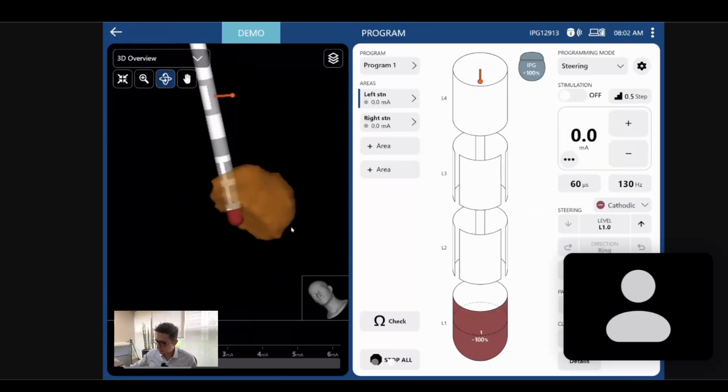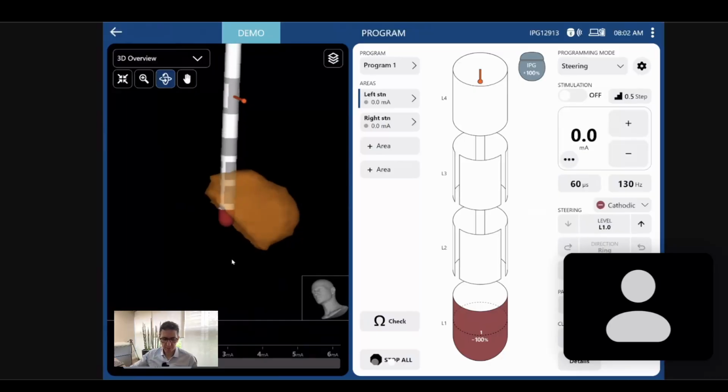Look at this. Again, maybe this contact can help, so I'm going to test my patient. I think that this one maybe would be the best, and I can tell you that I have already seen this patient and this is the best level, but maybe in the future this one. This I won't use because it's not needed, okay?